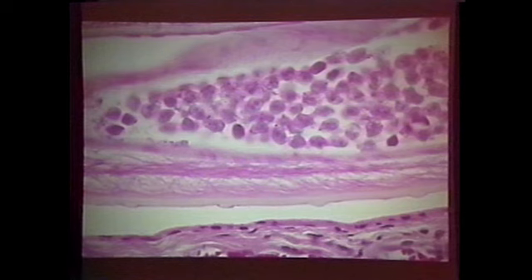All right? So a year and a half ago, there was one case from a dog from California. Now we have two more cases, and we have just received the fourth case from a valley south of Los Angeles. They must know that I'm in San Diego. But this has great importance not only in animal research, but in human research. Onchocerciasis is one of the top 5 infectious diseases by the WHO for people, because of the morbidity and mortality associated with the infection, and that we cannot control it.